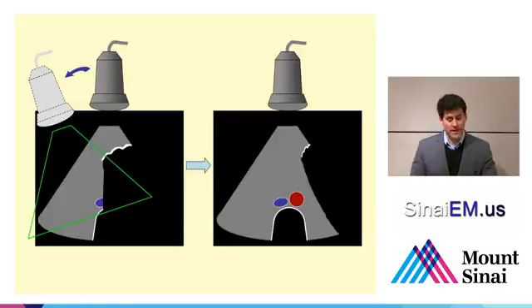Again, the same technique of keeping your probe in that position could be applied to either angling back and forth to try to find an angle on the abdominal aorta, or just maintain steady, gentle pressure. Or you could go more distal, have a look at the iliac bifurcation, for example, work your way back up again more proximally, and the bowel gas may have moved out of your way.